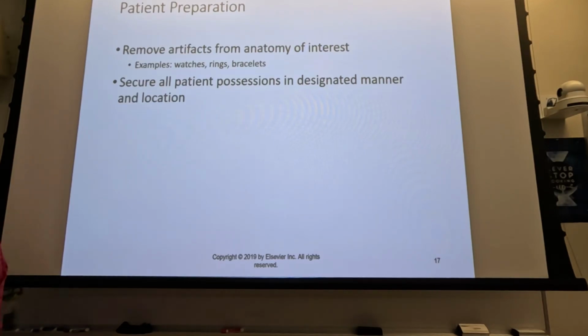The one exception to that is splints. If somebody put a splint on the patient, then by the book, by textbook, you should not remove that splint.